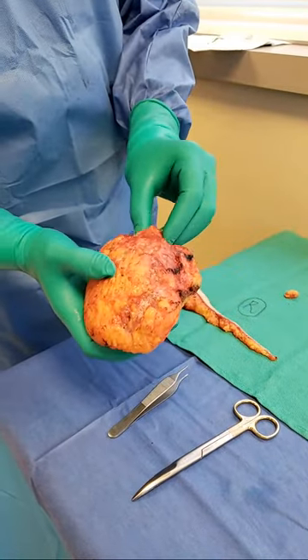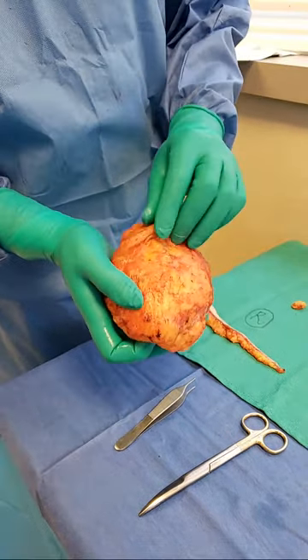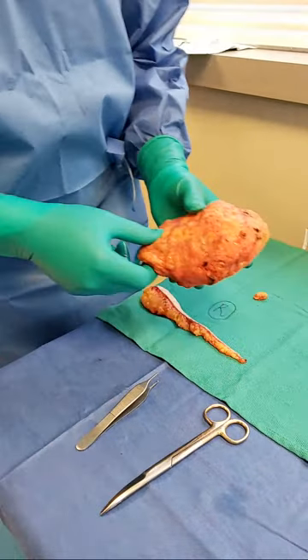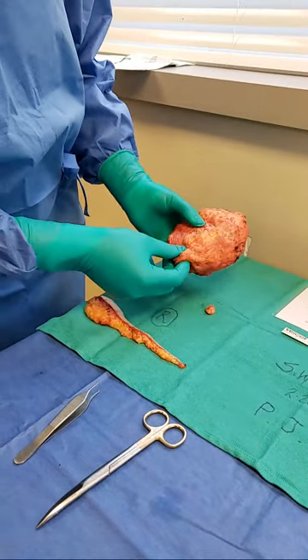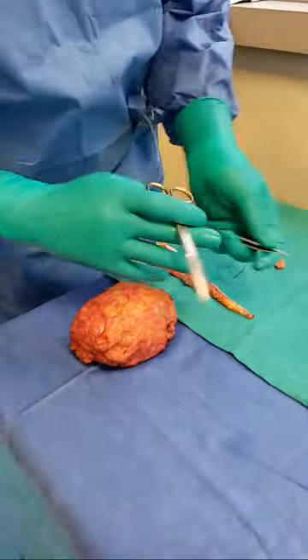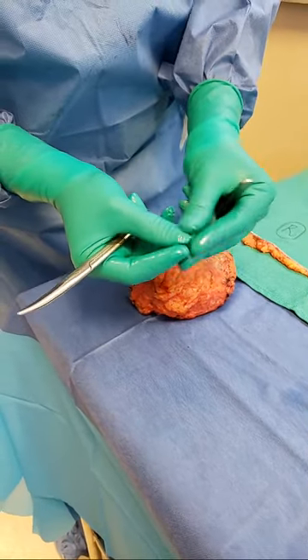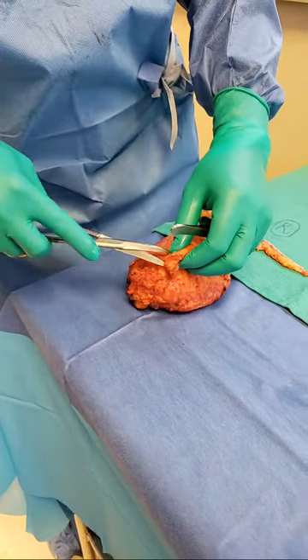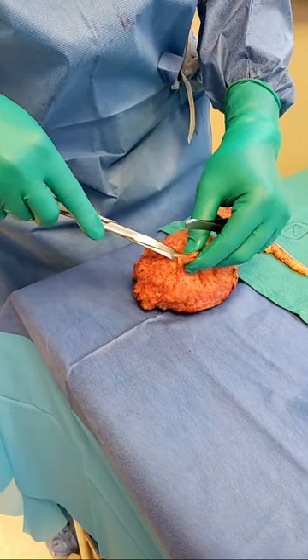All this inflamed tissue on the side — as I cut through, I'm going to actually cut through this one just to show. This is not healthy, good tissue. This needs to go, as much as the capsule, because this could be a focal rupture. This is a tissue mass I removed that was in the periphery. As I cut this open, there is this sliminess from the fatty tissue, but there is this extra irregularity, a sliminess that you see from what appears to be — look at this.